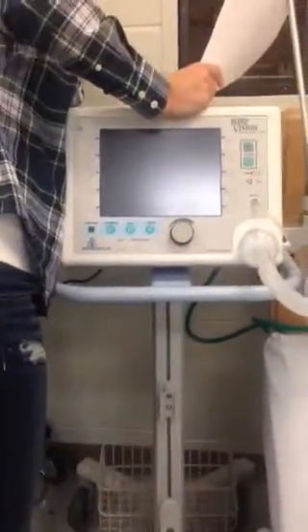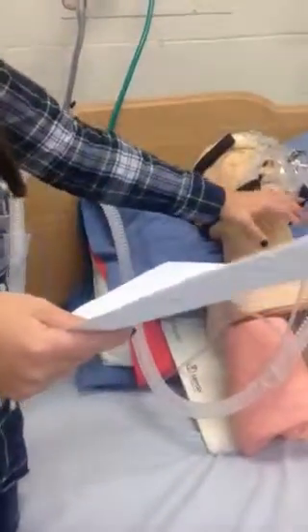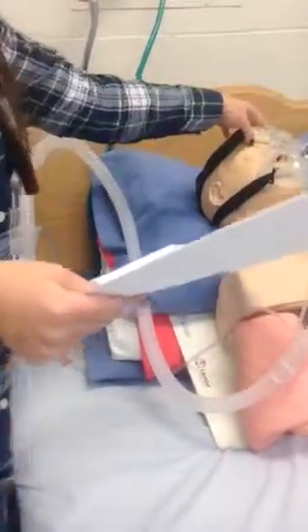I set the following parameters. She's going to wear an IPAP of 10, an EPAP of 5, an FiO2 of 35%, and a backup rate of 12. And I'm going to turn this on. And on this mannequin, I have placed a BiPAP mask, bridge of the nose, bottom of the chin, and it is snug on there but not too tight.